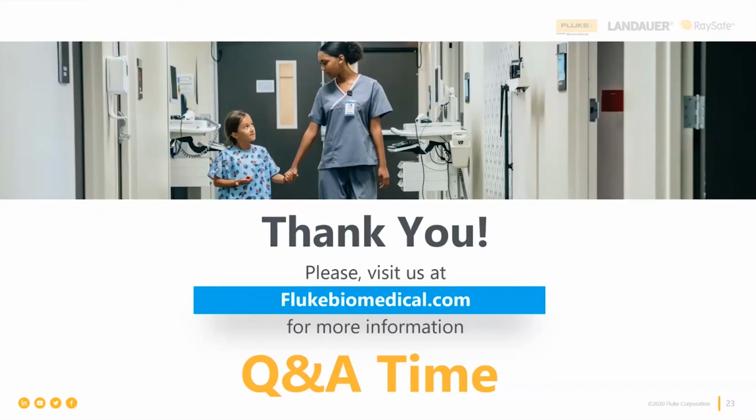So he's 100% right. The first time, every time. From so many years in the field, I can tell you we have found these defibrillators have had issues happen because they've been dropped, they've fallen, they're picked back up and stuck in, and not gone the whole way through. So I really do encourage you to stop and look at them. Look at the ones in your churches, in the malls. I mean, you may be surprised at what you find.